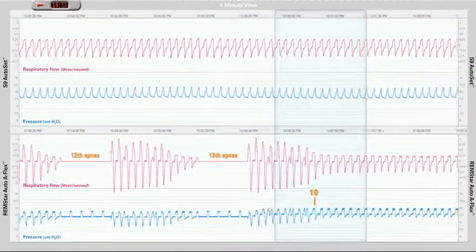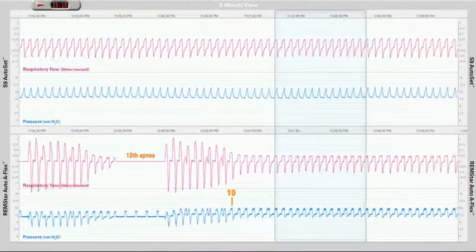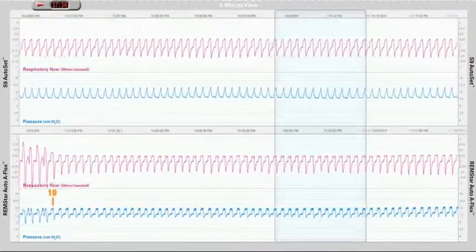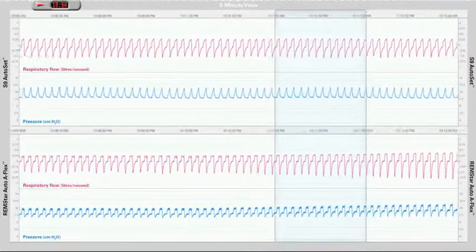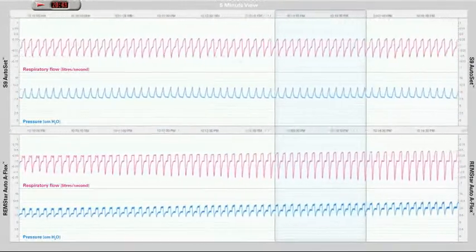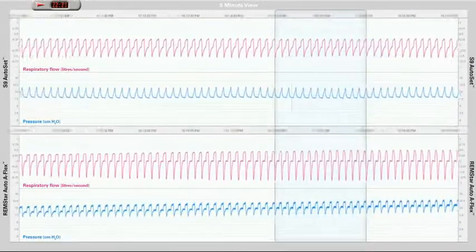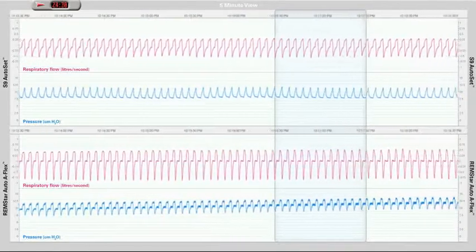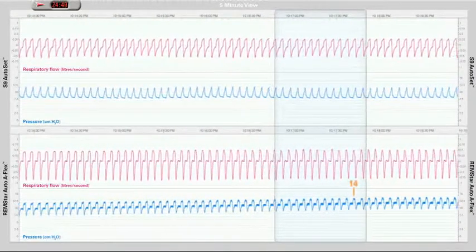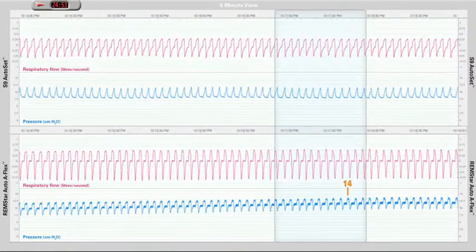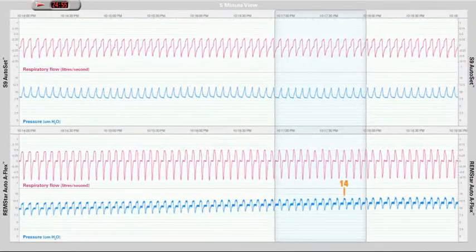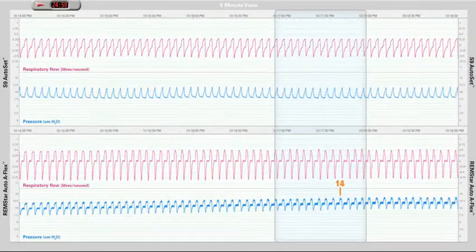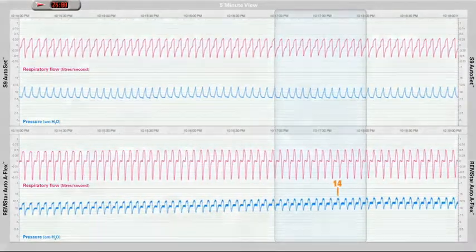At a treatment pressure of 10 cm, there is still evidence of flow limitation in the breath shape. It takes a further 12 minutes for the Remstar Auto to reach a final treatment pressure of 14 cm and eliminate all evidence of flow limitation. By this time, the S9 Autoset patient has had a stable airway for over 22 minutes.